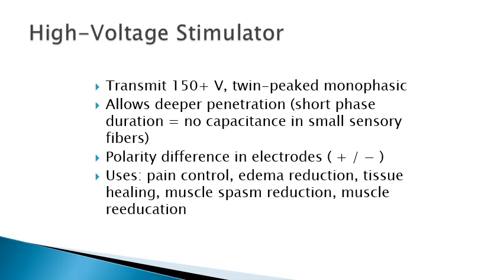If you're looking for tissue healing, wound healing, you would follow the natural healing current with it. So you start positive, then switch to a negative treatment. The negative treatment increases vascularity, fibroblasts, collagen and epidermal migration. It also inhibits bacterial growth. Positive charge increases macrophages, epithelial growth, and encourages clot formation. So they typically say start with the positive, then switch to negative when you're doing wound management or for tissue healing.